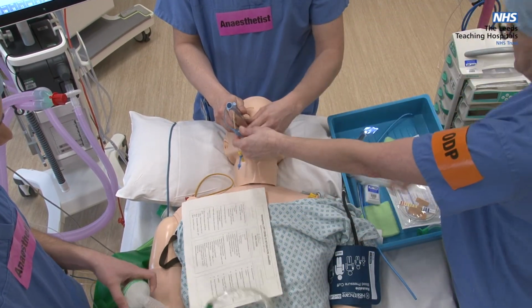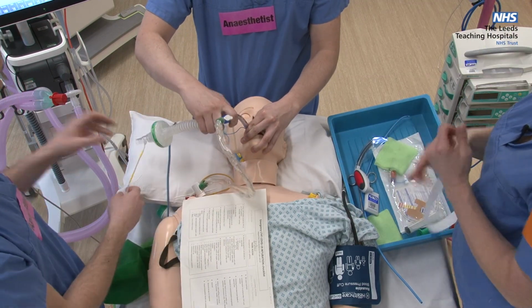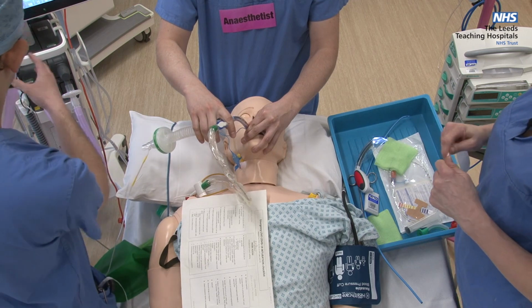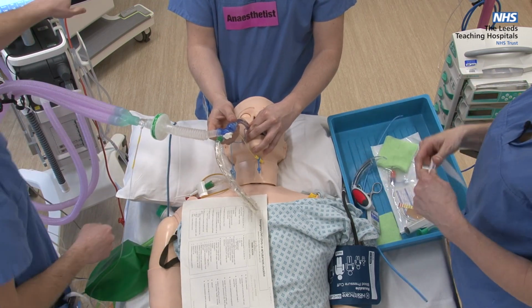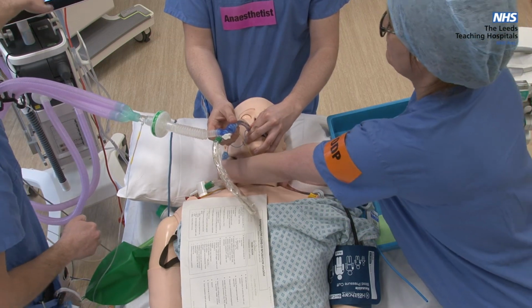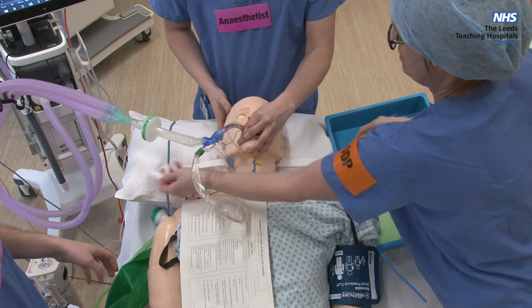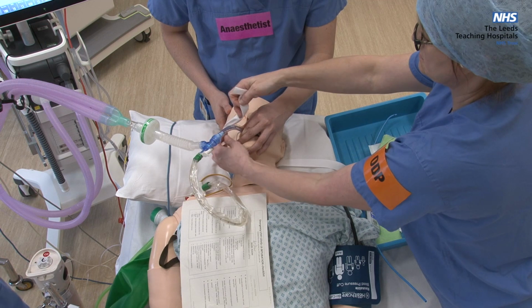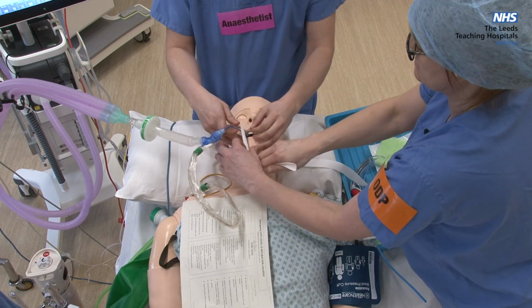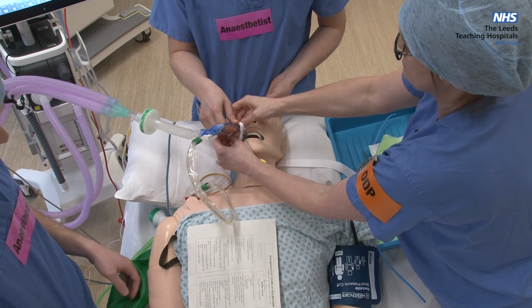Cuff up. Okay, so the circuit. Right, do you want to touch the ventilator? Okay, you're happy to begin ventilation. Ventilation beginning. And we have end-tidal CO2. And we have chest rise, but we're not going to listen with the stethoscope. Okay.